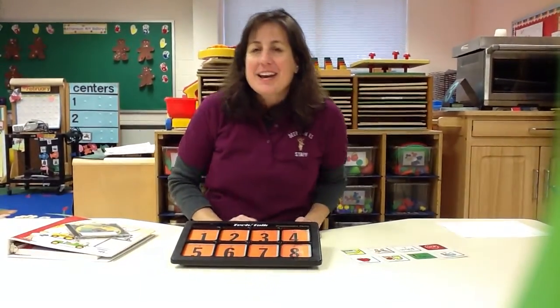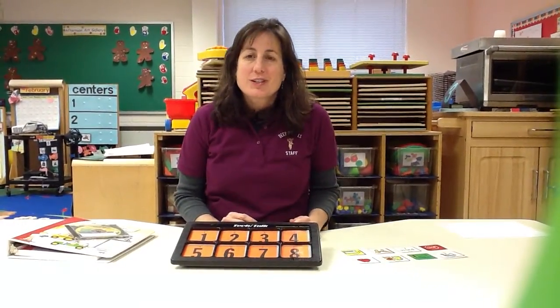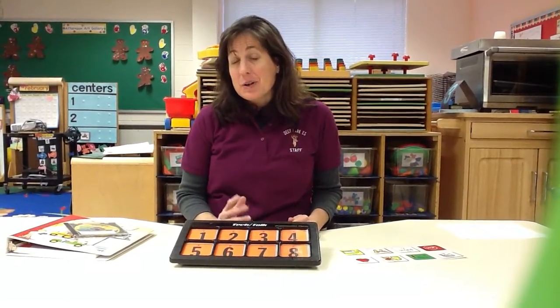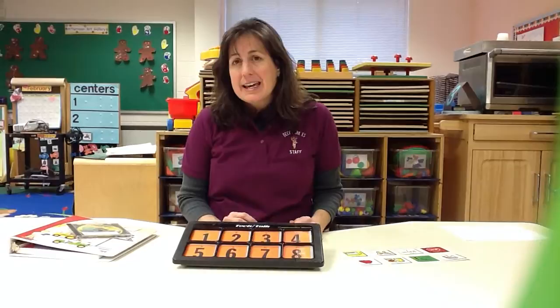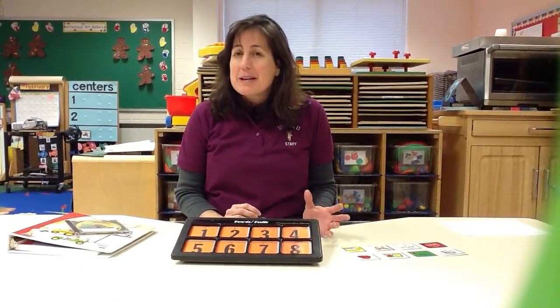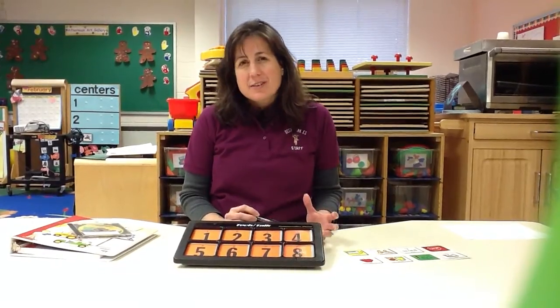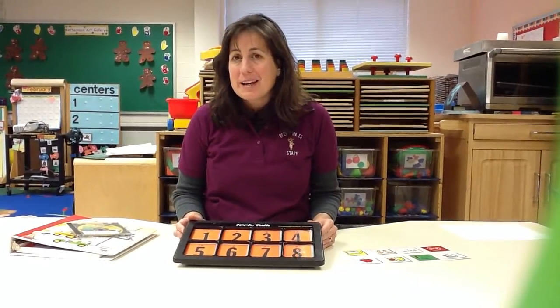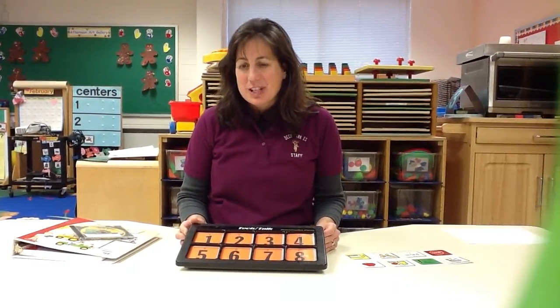My name is Carrie, and I'm a preschool teacher for students who have special needs. And many of my students have what you would call expressive language delays. They, for whatever reason, cannot speak. Maybe it's a medical need, or they choose not to speak. It's just difficult for them. And I want to show you a device that I'm hoping will help one of my students in particular.